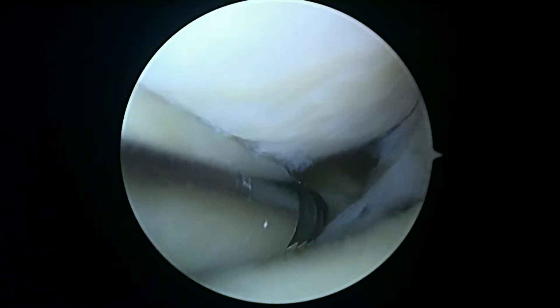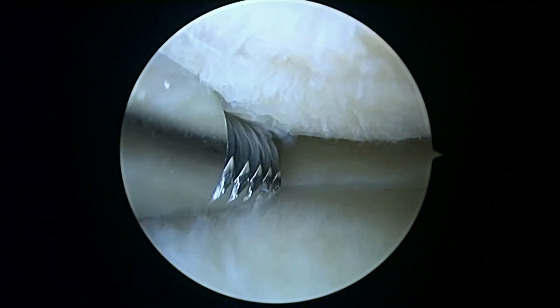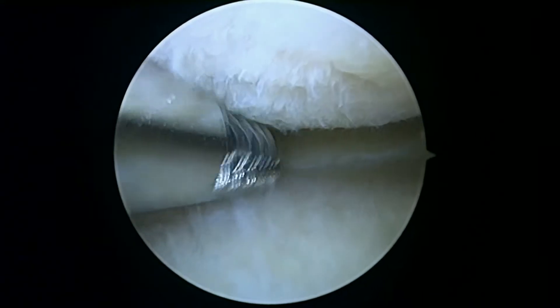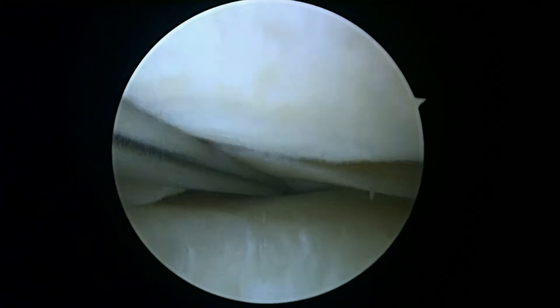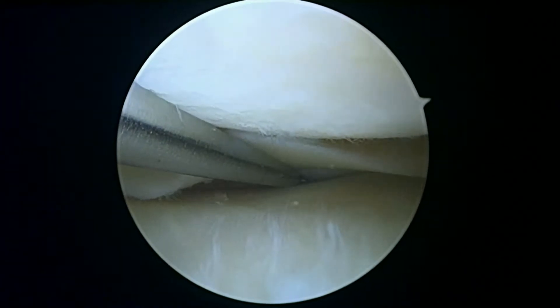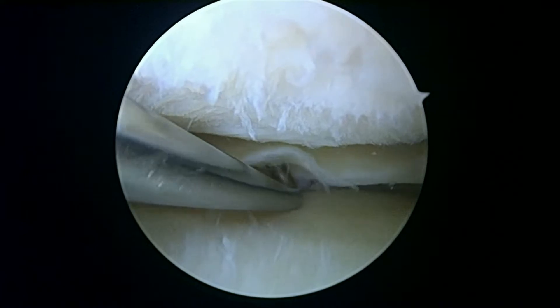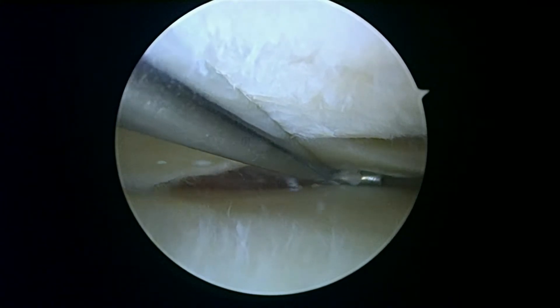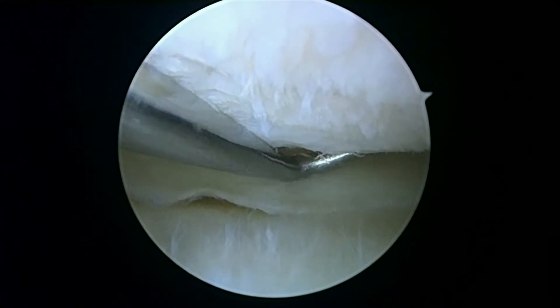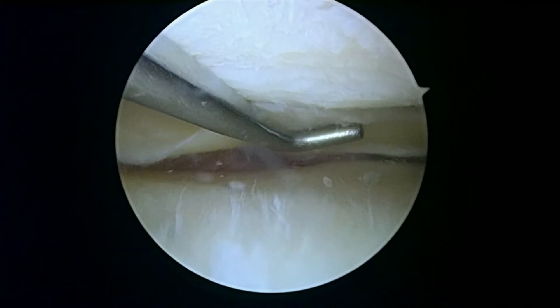So far, so good. There's maybe a little bit of a split tear away in the back here — you can see it right there. You can see, if you watch the probe, it's right where the probe disappears.